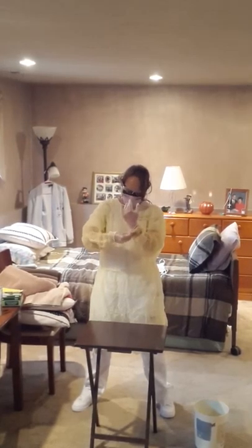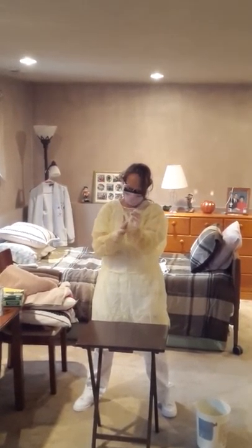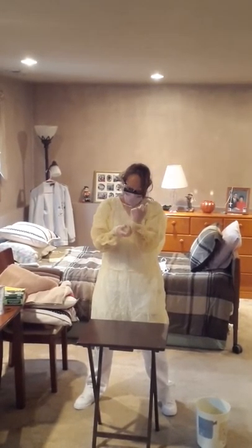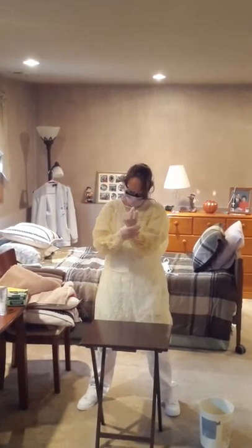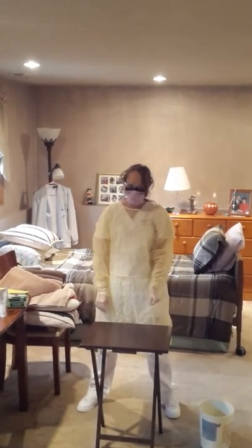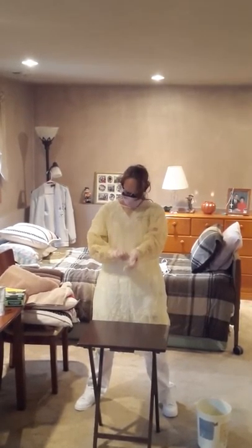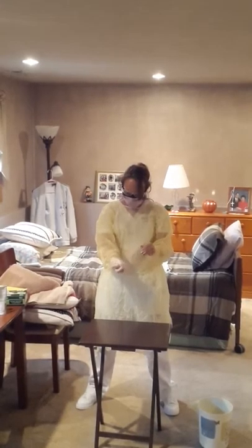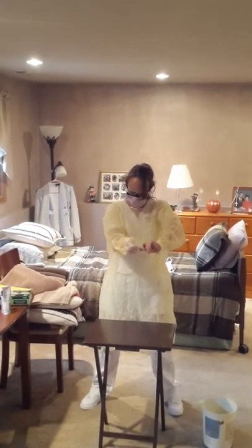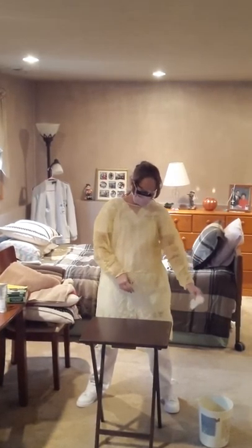Now I'm going to demonstrate taking off my equipment in the proper order. You want to do this at your patient's door and you want to make sure you have a proper waste receptacle to throw your equipment into. First, you take off your gloves and throw them away.